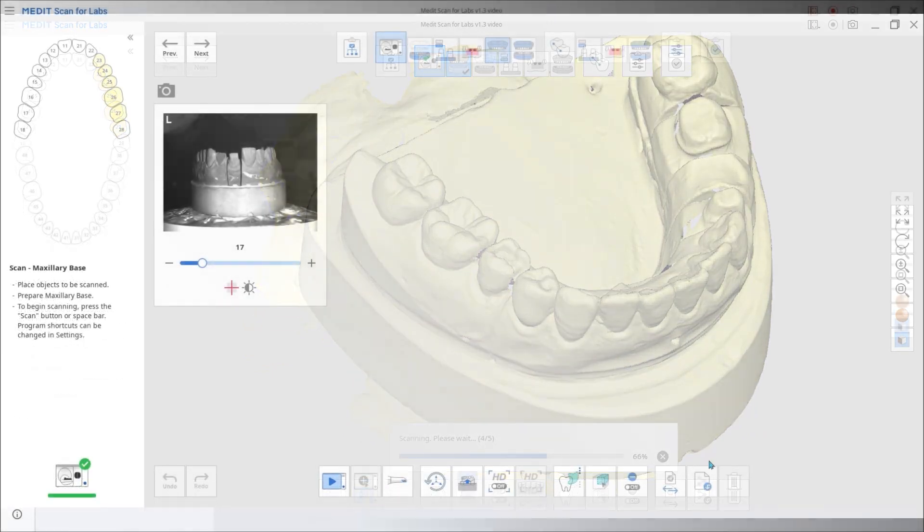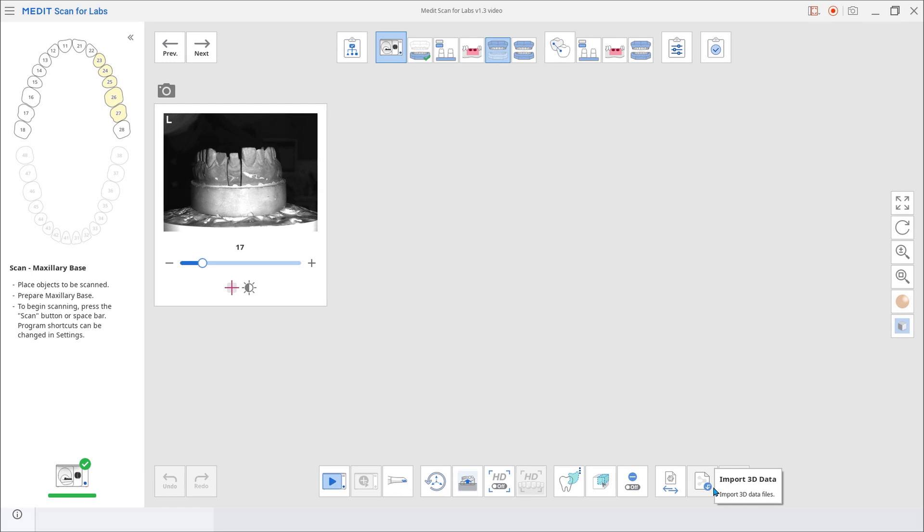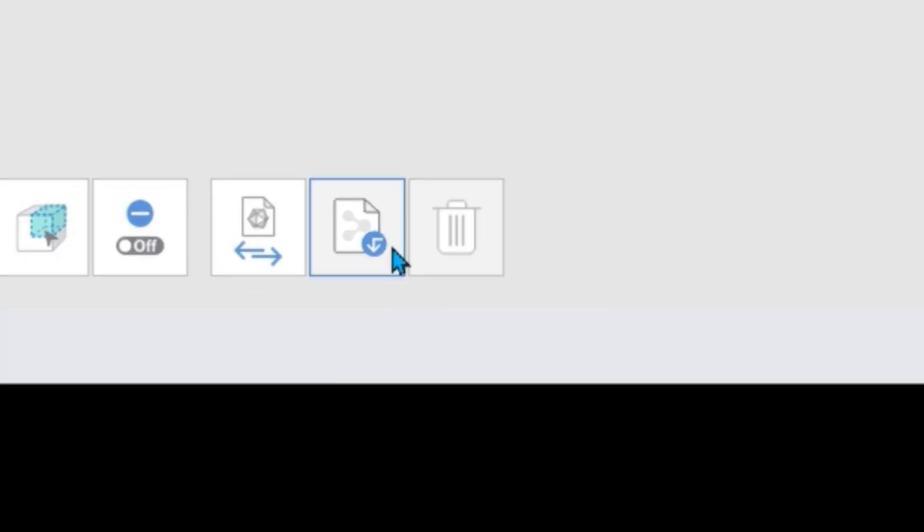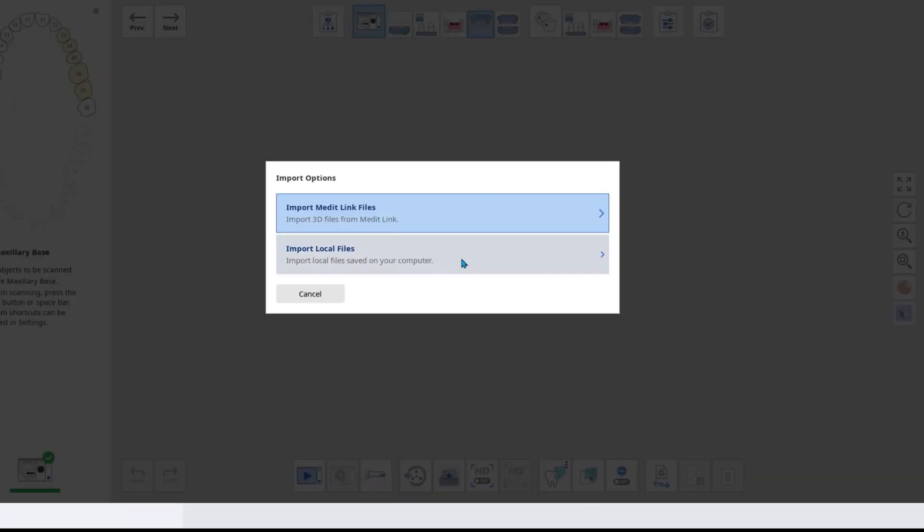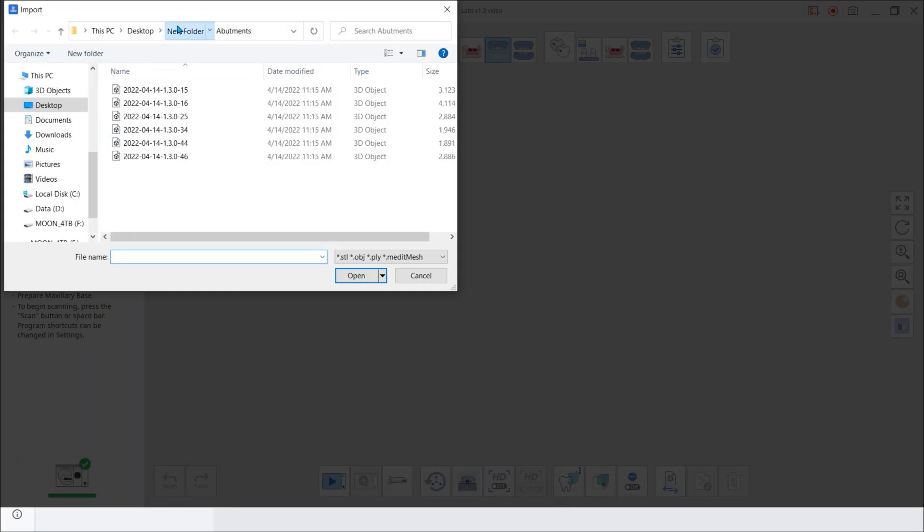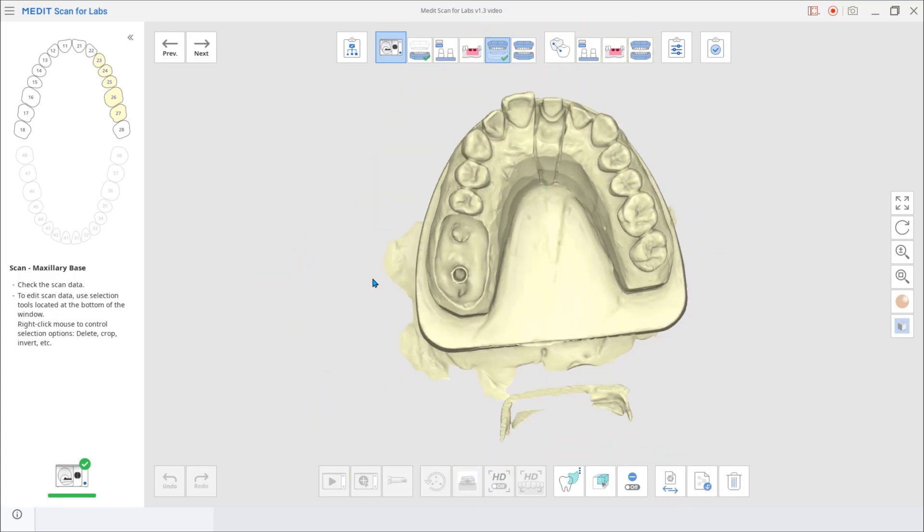And lastly, we'll introduce improvements made to file management. The updated version now includes an option for importing data, not only from MeditLink, but also directly from the local PC.